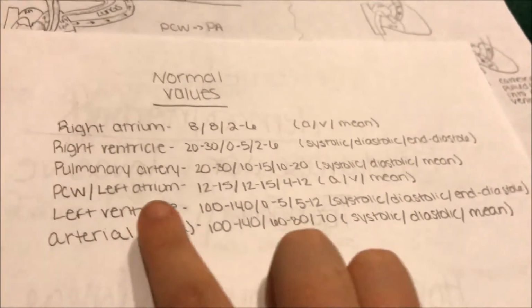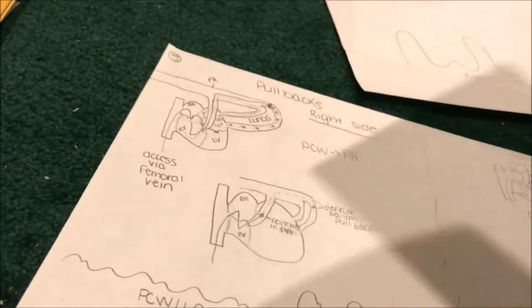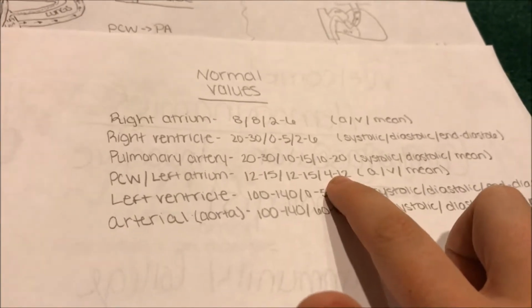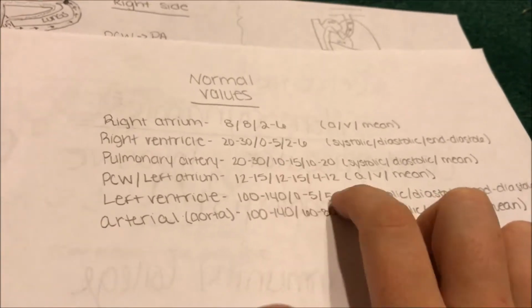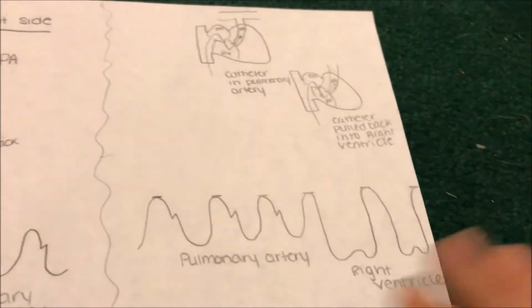It shows the PCW mean is 4 to 12, which equals the pulmonary artery diastolic of 10 to 15. So there's that.